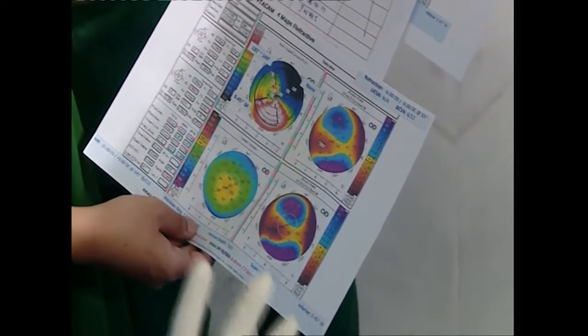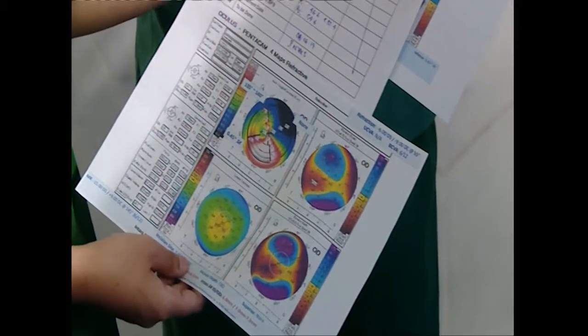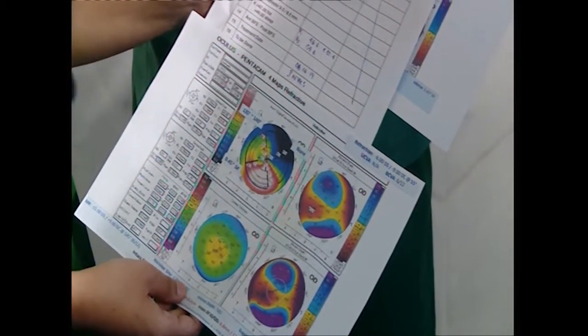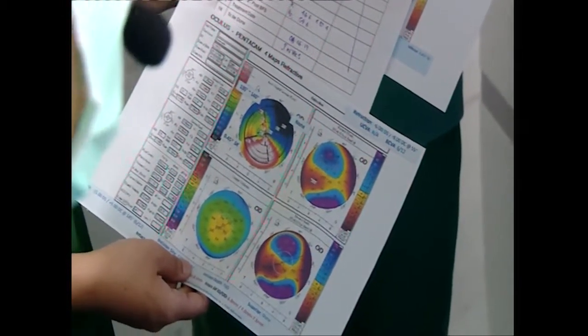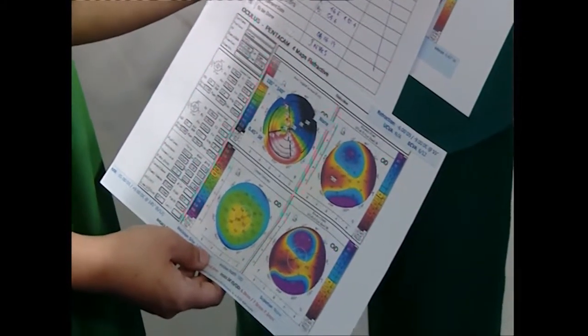You need to know the corneal thickness of the patient, and the peripheral corneal thickness is of significance. So his peripheral corneal thickness at the 6 millimeter zone is 580 micron. Then you normally would place your INTACS segment at 70% depth, but when the peripheral corneal thickness is more than 500, you could even get courageous and place it at 75% depth. And here the placement of the INTACS segment is at 430 micron, which is 75% of 580.